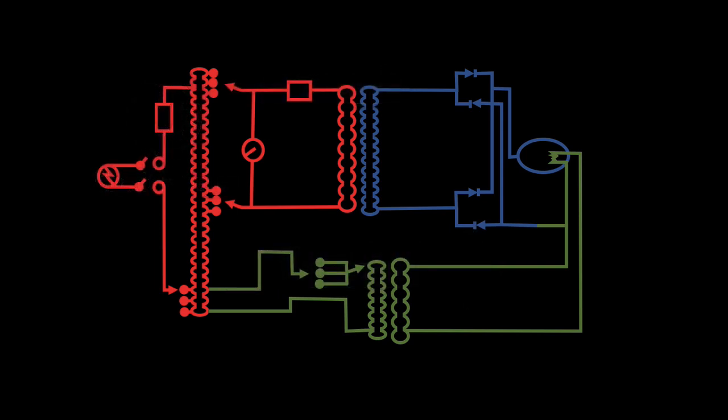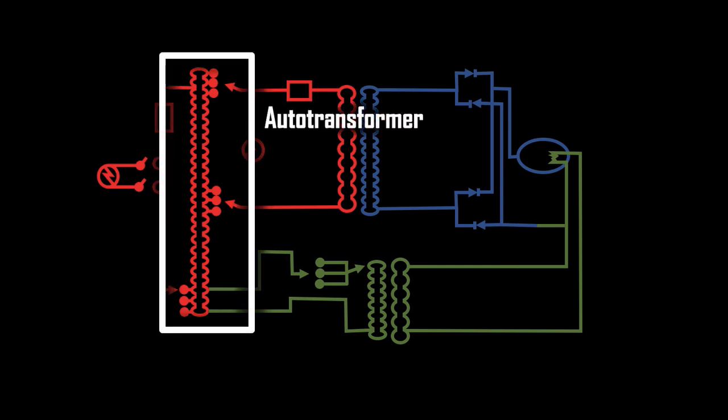The rest of the primary circuit relates to the primary exposure factors, especially the kVp. The electricity coming into the X-ray machine is 220 volts, but that's not enough to make an X-ray. In radiography, we need to use more than one voltage setting, and we need kilovolts, not just volts. When the technologist sets the kilovoltage potential, that's the kVp, this change occurs in the circuit through a device called an auto transformer. Without the auto transformer, we wouldn't be able to change the kVp to different settings.